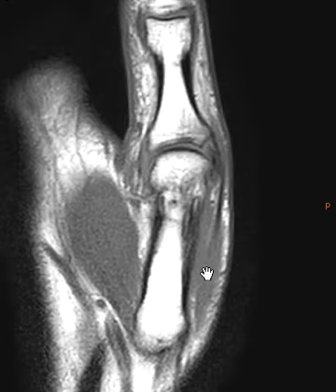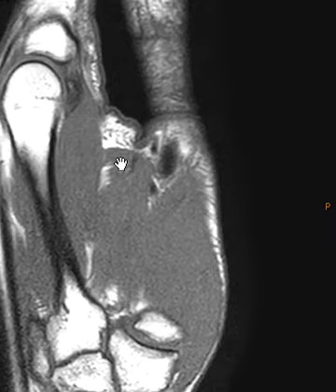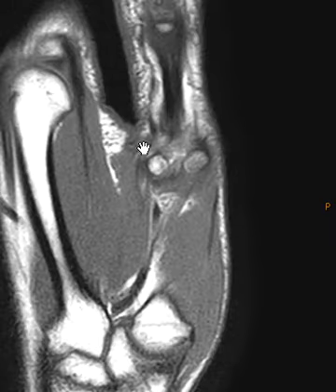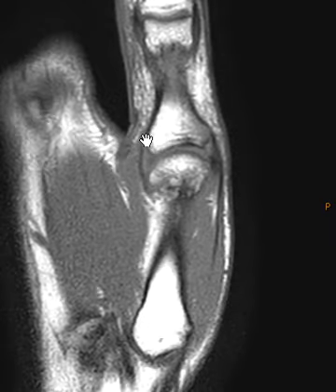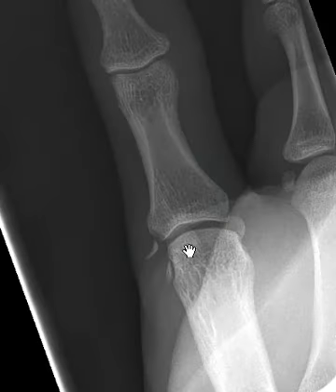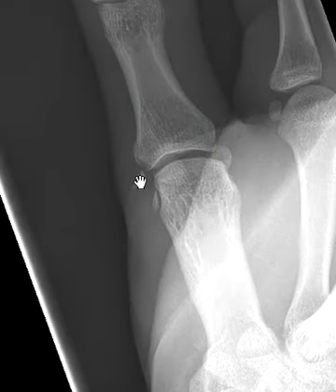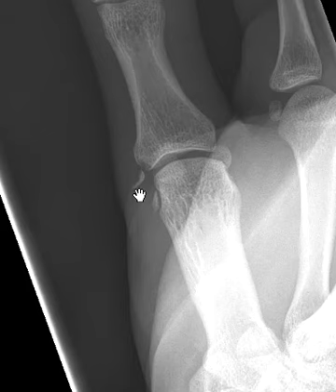So this is the abductor on the outside, attaching way over here in the base, and this is the adductor over here in the thenar region, closer to the hand, that comes obliquely horizontally here and attaches over on the other side in this broad aponeurosis. So now I'll show you the x-rays that show the fracture here. You can see this is that fracture fragment that should be here, but it's rotated down. That abductor pollicis brevis tendon attaches right there, and it yanked it right off.